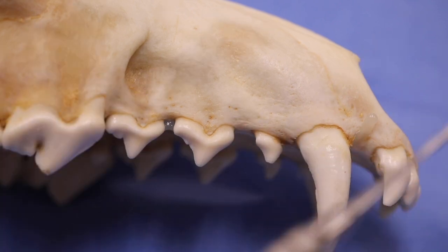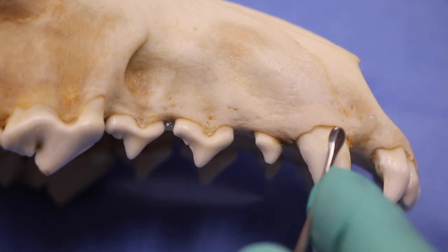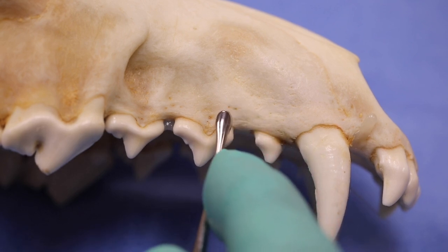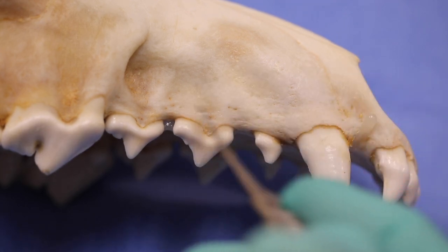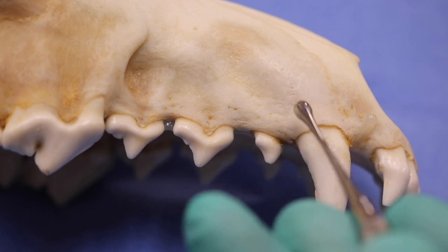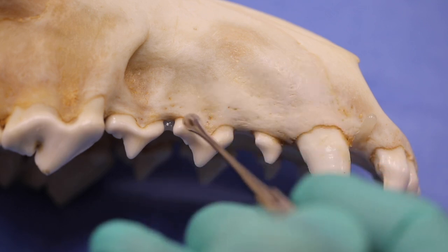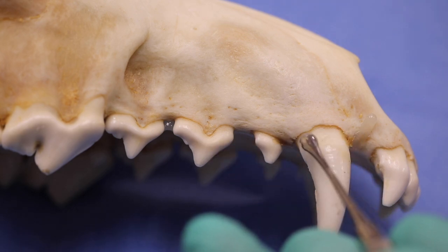This moves the tissue off without putting forward pressure, but mainly putting pressure downward onto the bone. All those concepts are the same when we turn the elevator over. After we've got that margin started, we use the large end and can get much more aggressive, using the same concept of turning that attached gingiva off of the bone. Once the attached gingiva has been lifted, we can get more aggressive and start to move apical, pressing down on the bone and moving apical into that unattached gingiva, which releases quite nicely and much easier than the attached gingiva.